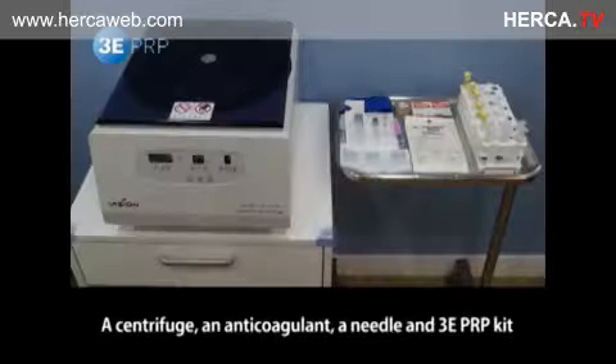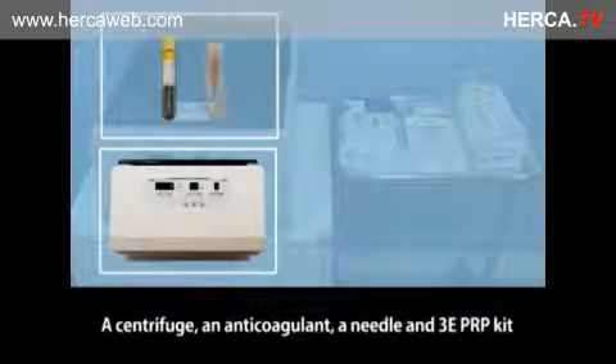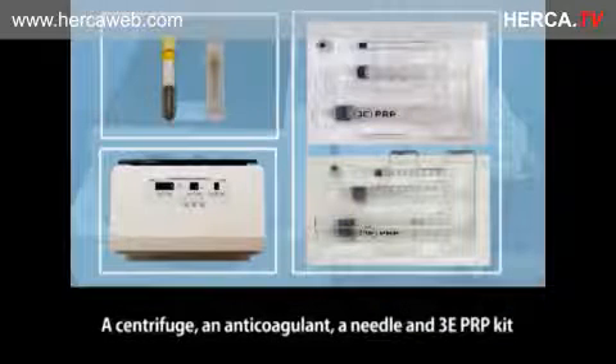This video describes how to use 3E PRP. A centrifuge, an anticoagulant, a needle, and a 3E PRP kit are needed to extract PRP.